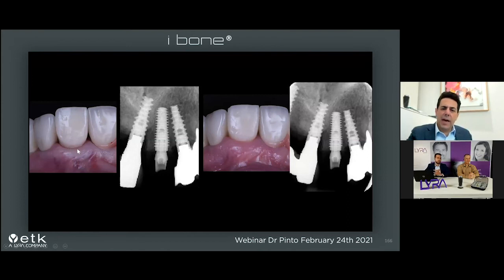The gum is a little bit high, and we see that with this kind of surgery, even if the implant is a little bit deep. You need to be deep, in my opinion, in this case, on extraction with immediate loading, we need to put the implant a minimum of 4 millimeters below the level of the gum, okay? And now we see only 2 weeks between these two pictures, and we see that the gum is growing onto the temporary, so we are happy.